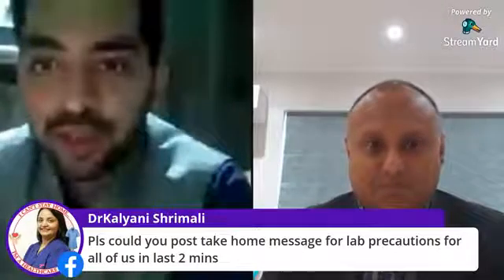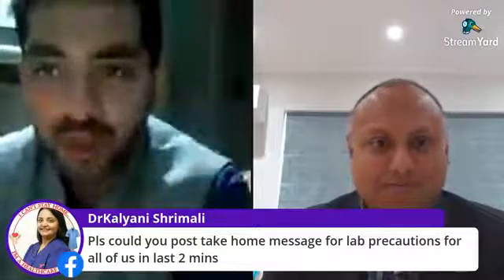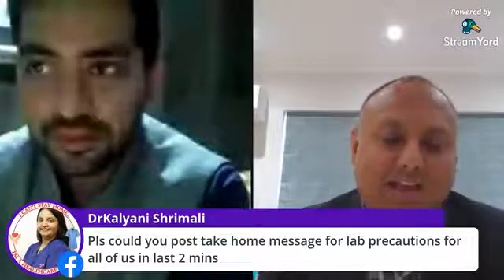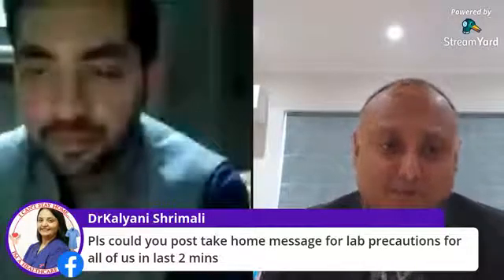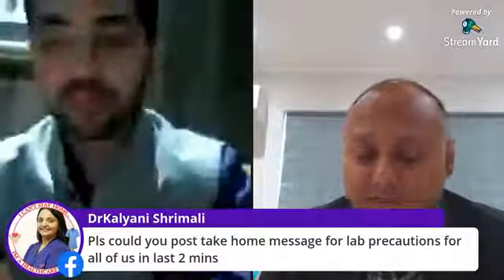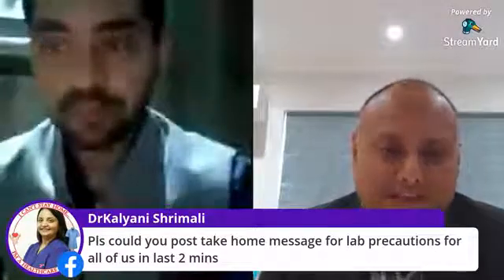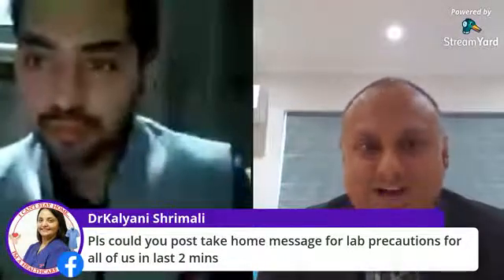So Alpesh, last 2 minutes, can you just sum up the key points and the way that we all should go ahead for our clinics, and then we can end this. Sure. So in a lab, the three things I'd like to say are: use the correct PPE, that is very important. Try and minimize your exposure to native fluids, especially when you're doing egg collections and sperm preps. Save your samples in terms of the vitrification side of things. Consider using a closed system, and make sure that your aseptic techniques and your disinfection protocols are very, very thorough and robust, especially in this current climate.